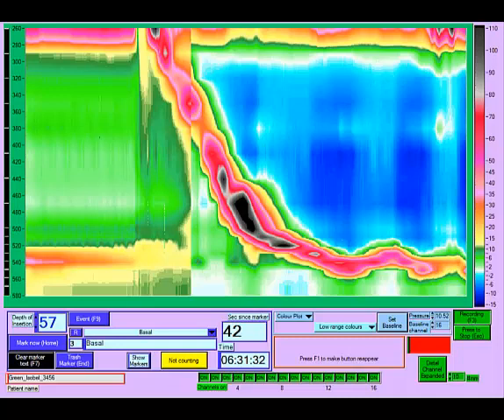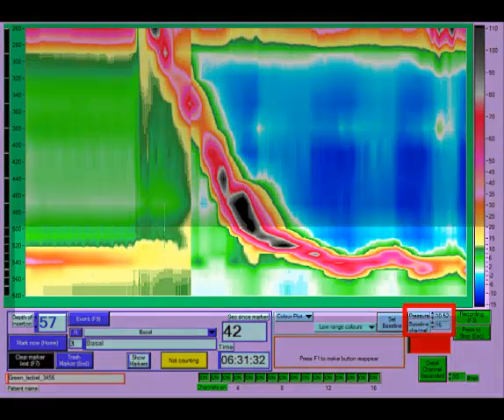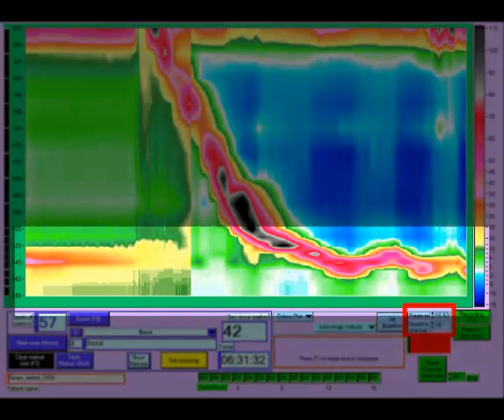In order for the display to look right, you will now need to set the baseline pressure to intragastric pressure. The background pressure will be set to the instantaneous pressure in the selected baseline channel, and will be subtracted from all pressure values to correct the colour display so that the intragastric pressure becomes 0 millimetres of mercury or white.